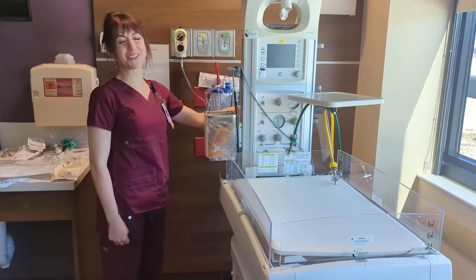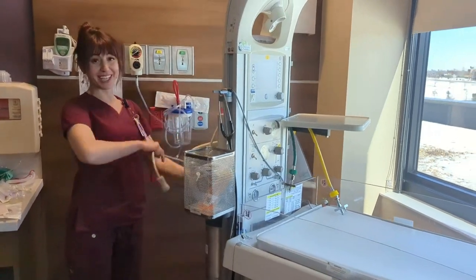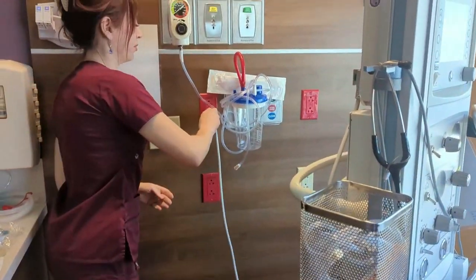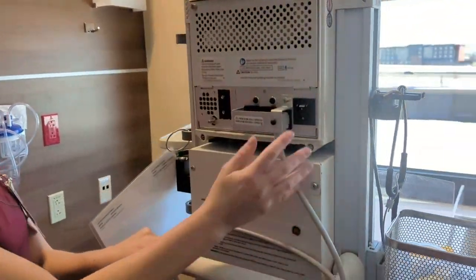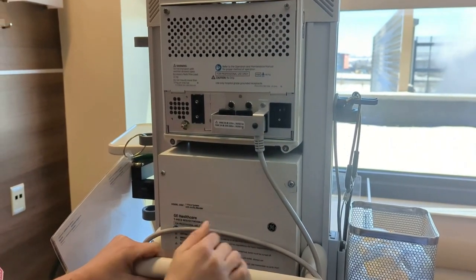Hello and welcome to Warmer Setup. The first thing we're going to do is plug the warmer into a red port. Next, as you can see here, there's a little circuit breaker switch. We need to always have this on in order to work.